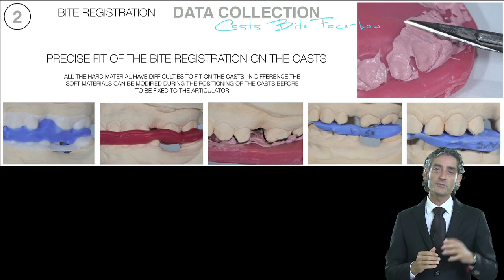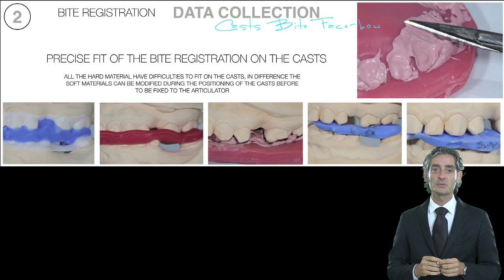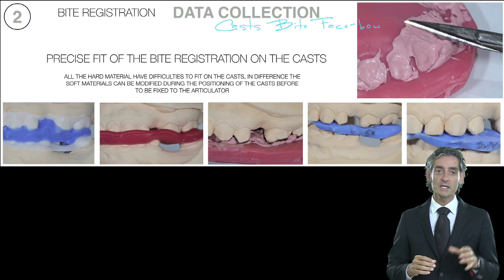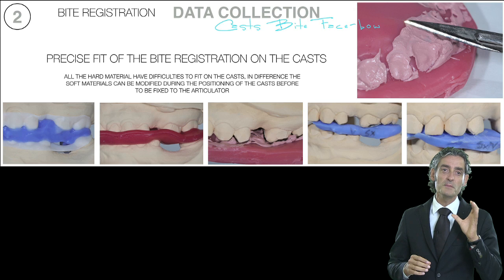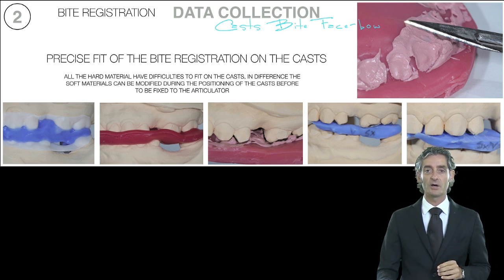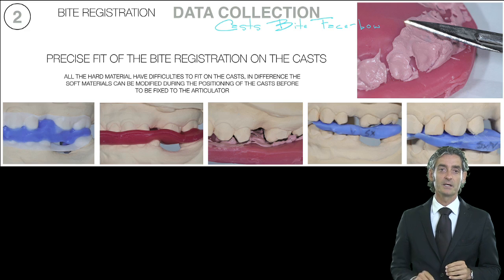For this reason, if we start with the plastic foil, as we have on the left part of our screen, it will be much easier for the technician to find the occlusion and the precise position of the arches.